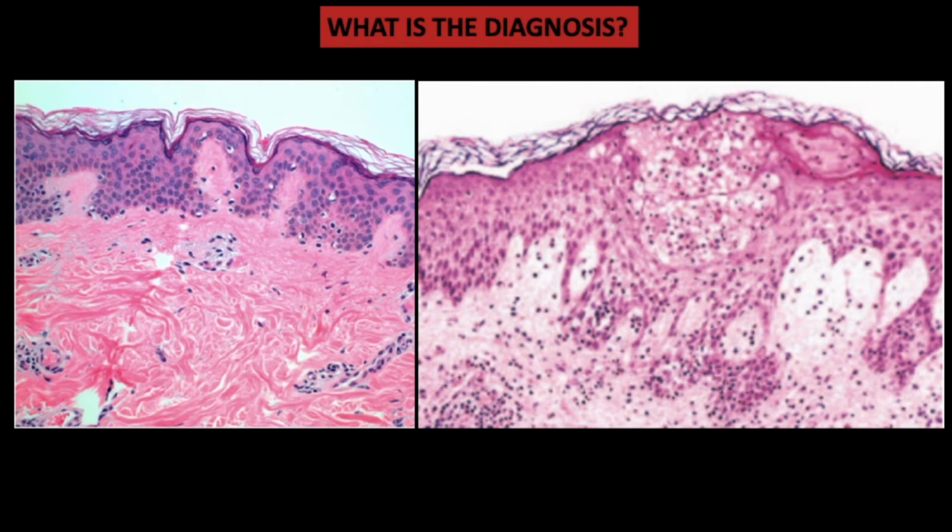Remember, we are talking about spongiosis, so spongiotic reaction will be the main theme for all these diseases. And if the spongiosis is severe enough, we may see the vesicle formation or the blister formation. And the other thing I want you to think about when you are approaching those lesions is, what is the specific cell type that we see? Are there any neutrophils? Are there eosinophils? Is there some other feature that is unique for this disease?